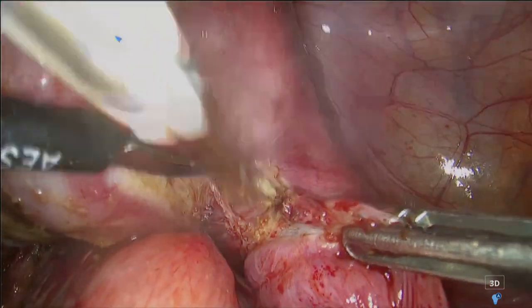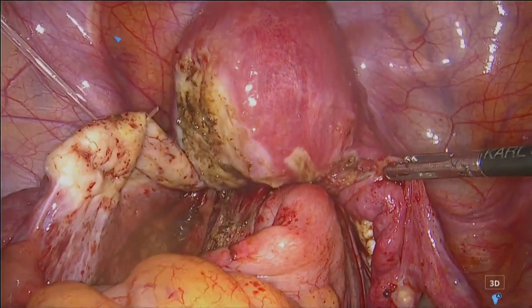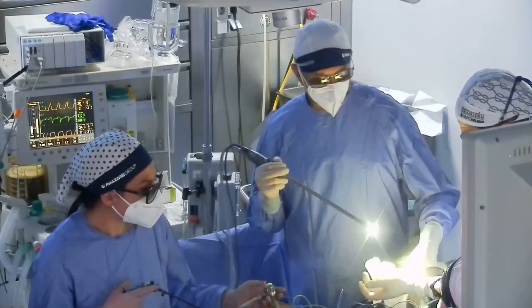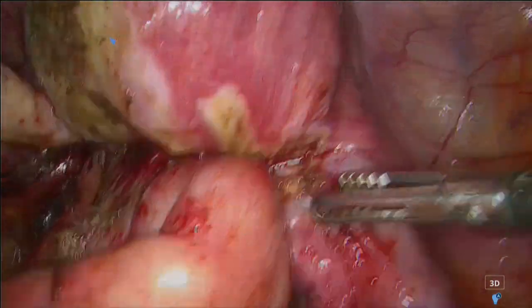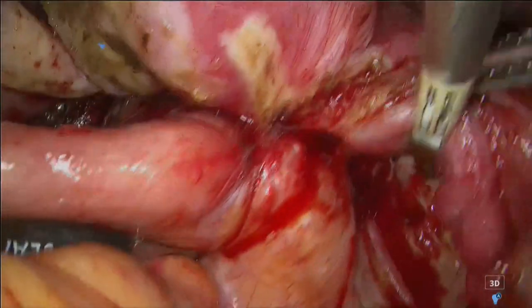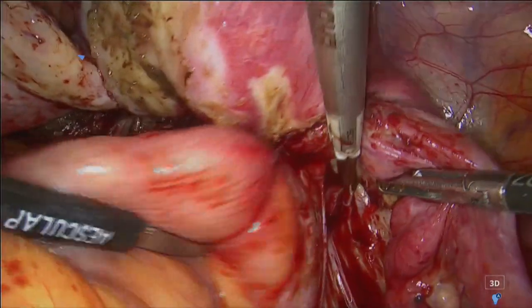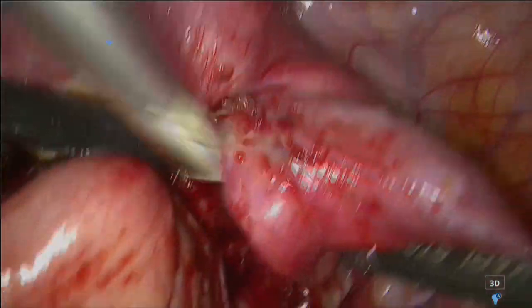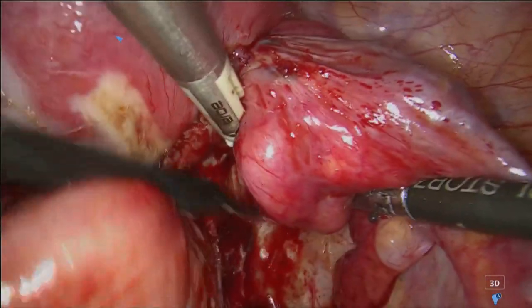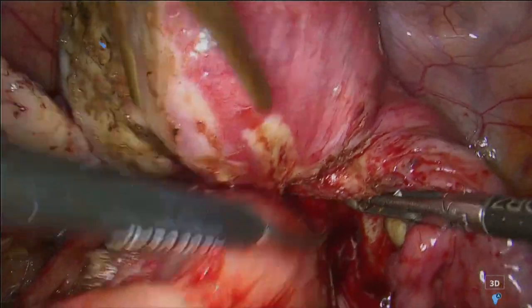Okay, so this is the direction of the tube. Probably we have to remove the tube. Probably the right one, but we will check the tube later, and then we decide whether to remove it or not. Okay. For the moment, it's better to try to free the part of the ovary here. Probably it is not possible for the moment to put the right T-lift. We can do it after.